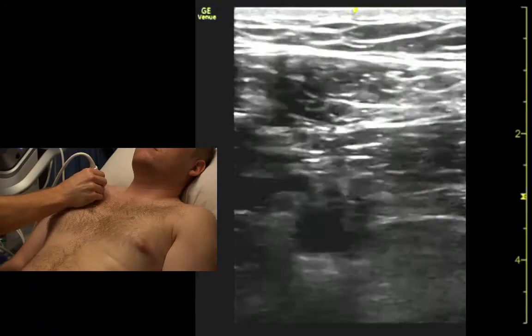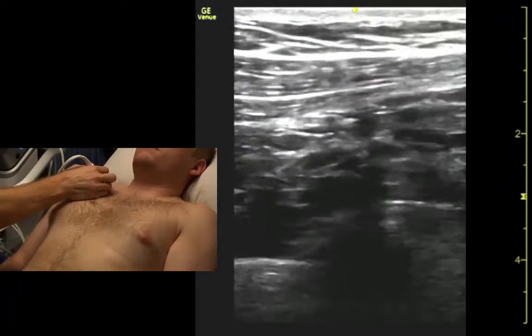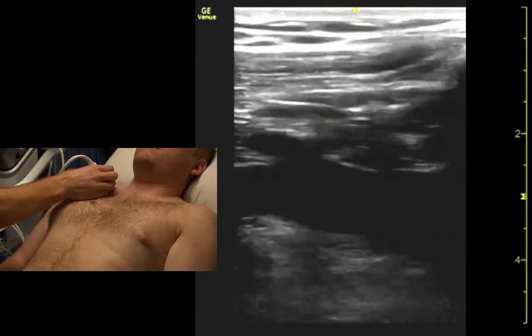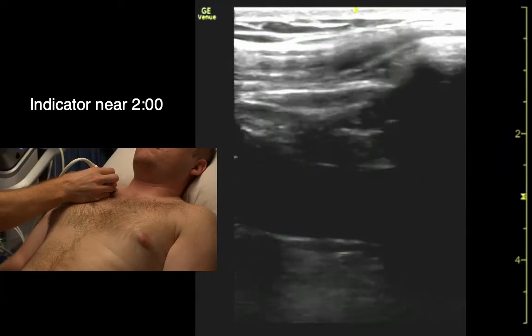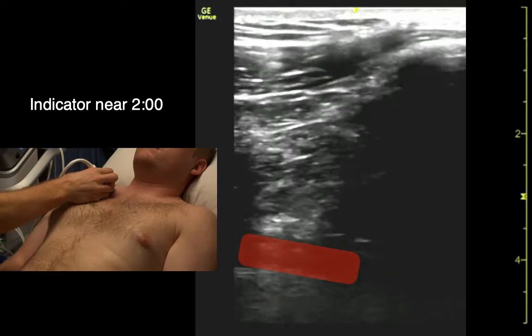That's a good target for central access too. Bear down again. So there's the vein — we could target that for central access — and the artery's a little bit deep.